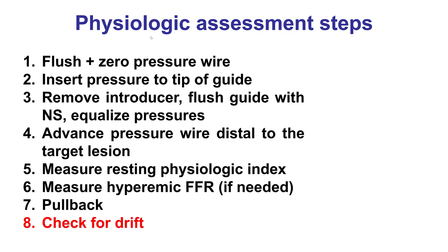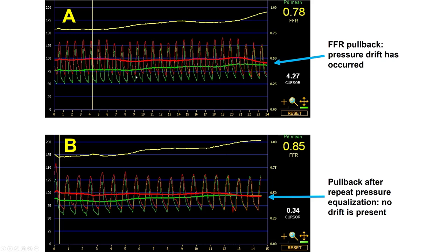The final critical step is to check for drift, because sometimes there is drift in pressure leading to inaccurate measurements. On pullback, when returning to the guide, there should be no gap between the aortic pressure and the pressure wire — they should be identical. In this example, a drift was identified, re-equalization was performed, the wire was re-advanced distally, and the pullback was repeated. This shifted the FFR from 0.78 — which is significant — to 0.85, which is not significant and does not require treatment.